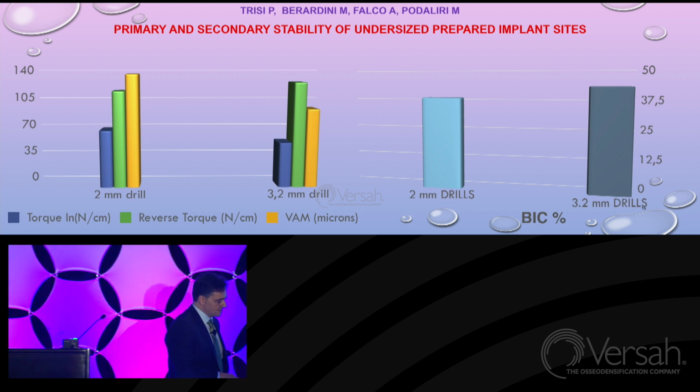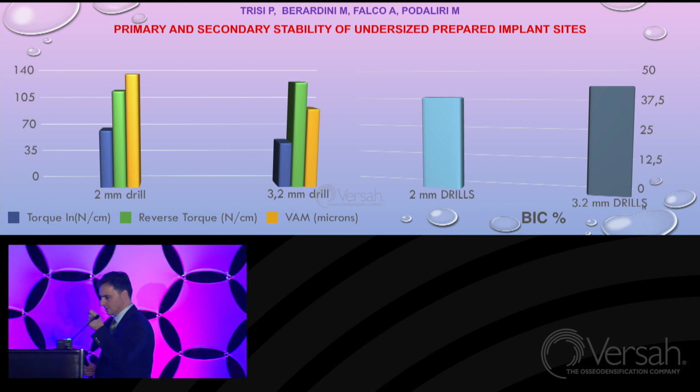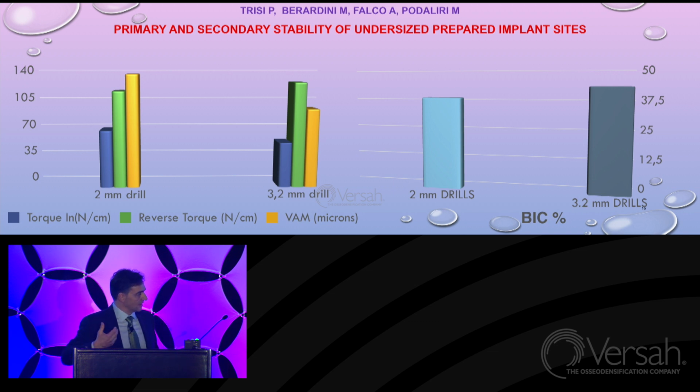If we see the histologic analysis, we can find that 2 millimeter implants had a bone to implant contact a little bit lower than 3.2 millimeter implants, 3.2 holes. There is something that disturbs the healing if we undersize the preparation. And we will see later some histology that can help us to understand.